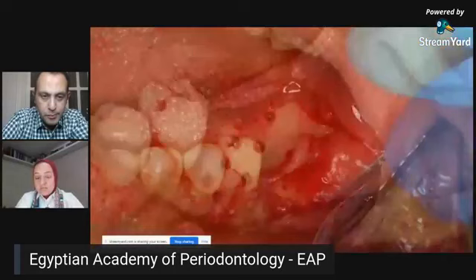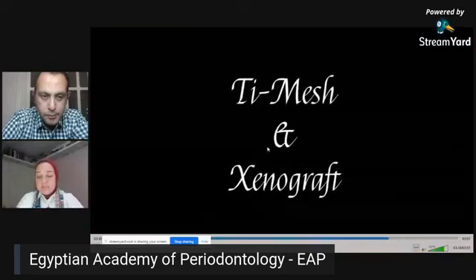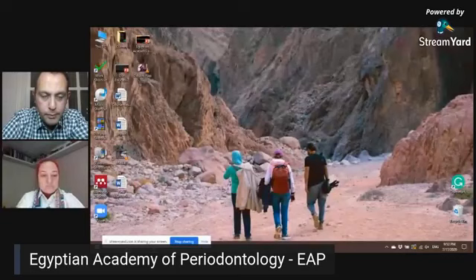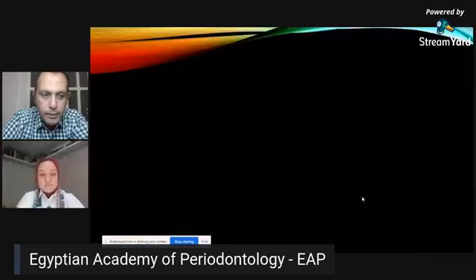This is how the decortication looks like. It allows the flow of the blood supply to the graft material, as we said. We can stop the video here, and I will continue with my case. I hope you can see it clearly now. Yeah, we can see everything.